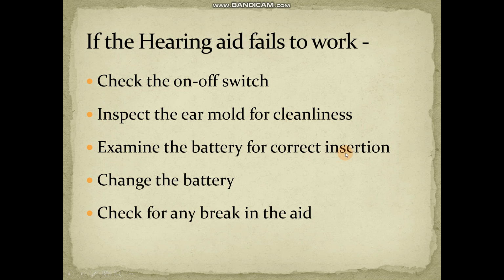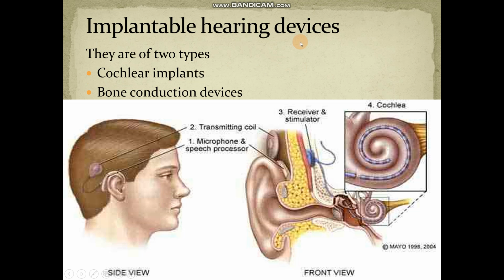Examine the battery for correct insertion. Change the battery if needed. Check for any break in the aid. So this all should be done if the hearing aid fails to work.